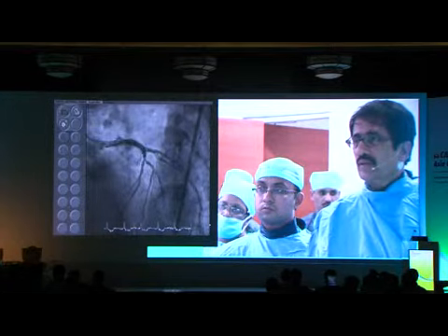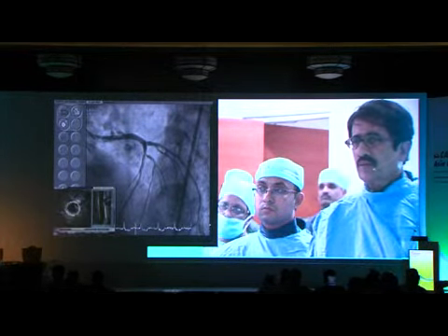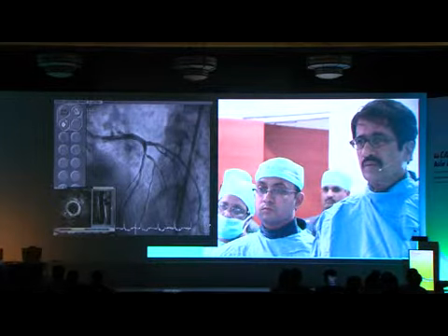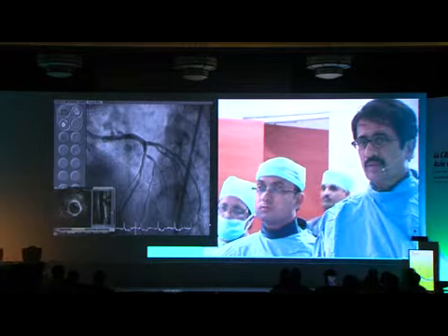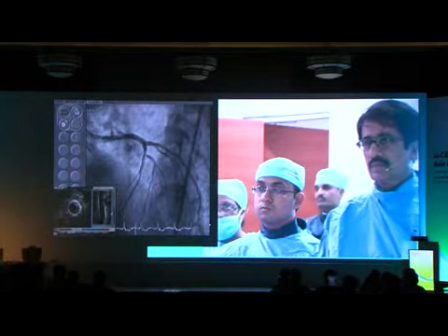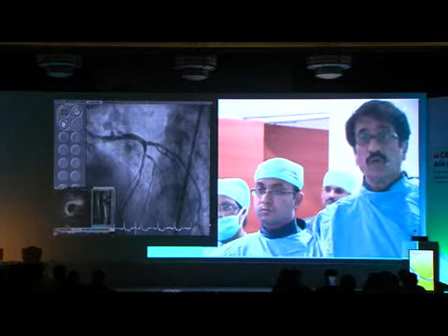What are you seeing, at the angio or IVUS? We're seeing the angio and the IVUS actually both. Even on the angio in left anterior oblique view, I'm quite convinced that LAD has a very significant stenosis. I also think that it is an eccentric lesion, and that's what I think we are going to see in the IVUS also.